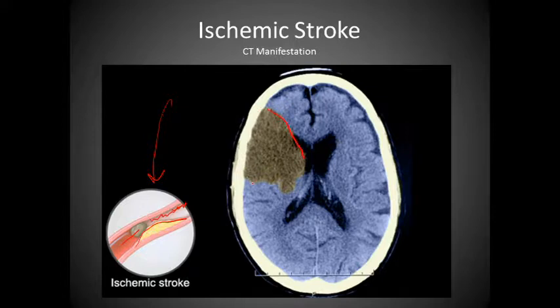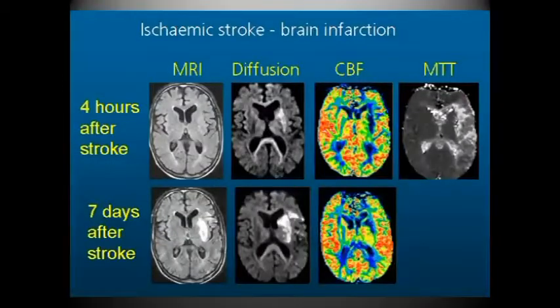This area looks more of a wedge shape than what we saw, and as we can see, this is one of the least traumatic areas that we saw, because notice there's no midline shift. There might be slight compression of the right lateral ventricle to some degree, but not much, and it doesn't comprise a large portion.